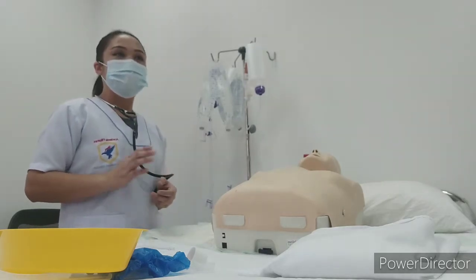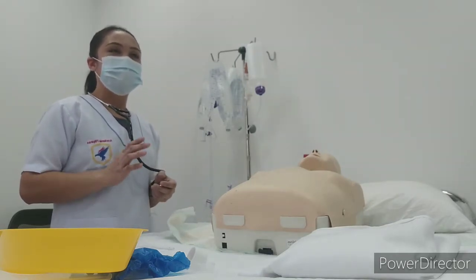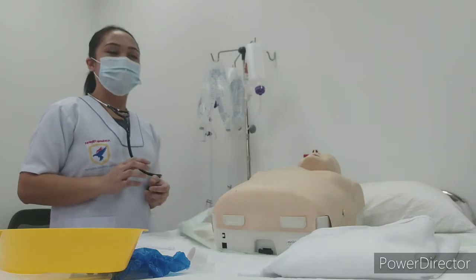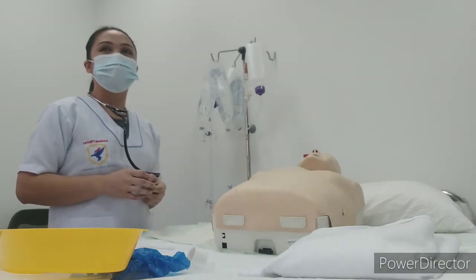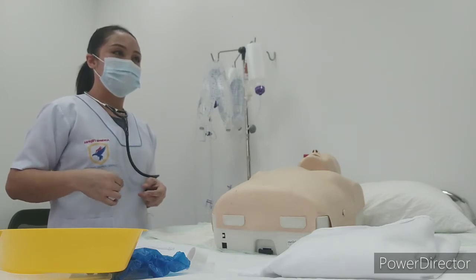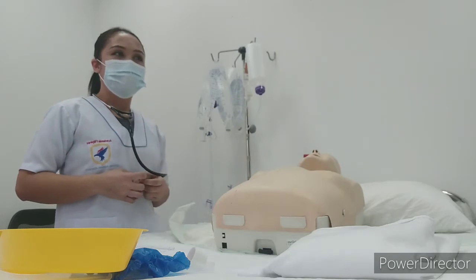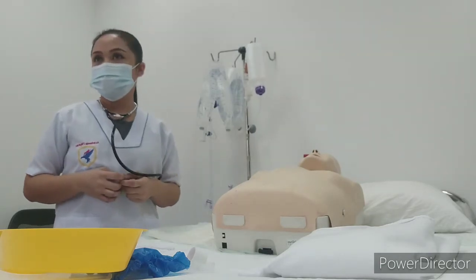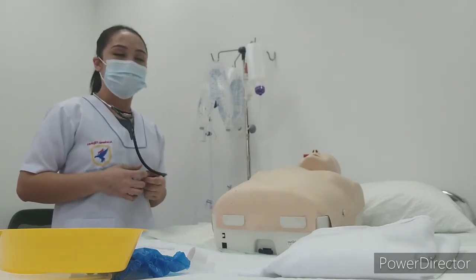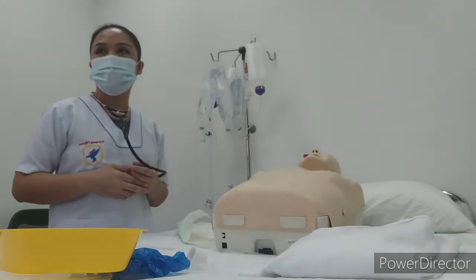PEG tube means, PEG means P is for percutaneous endoscopic gastrostomy. So it is the tube which you connect to the open wound in the abdomen direct to the stomach. Okay, so why do we do the NGT feeding? To provide comfort to the patient and to give nutrients to the patient.